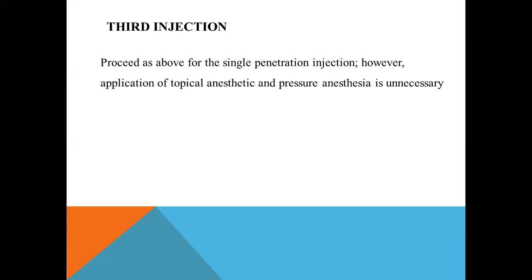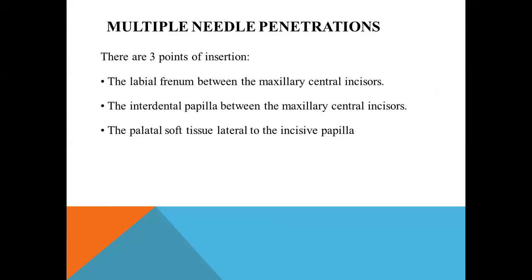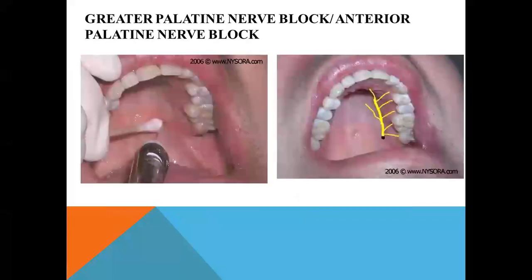For the third one, proceed as above for the first penetration. The same thing has to be done for the third, because the third is the palatal soft tissue lateral to the incisive papilla. So the same thing has to be done.